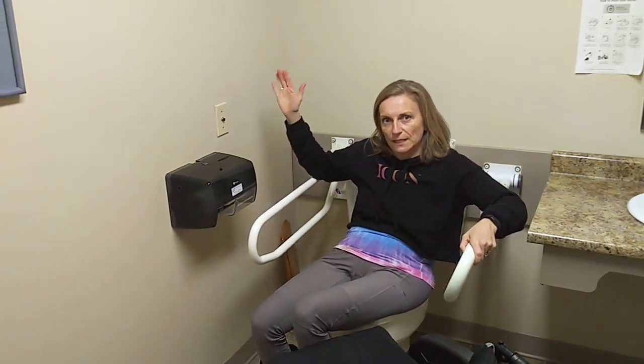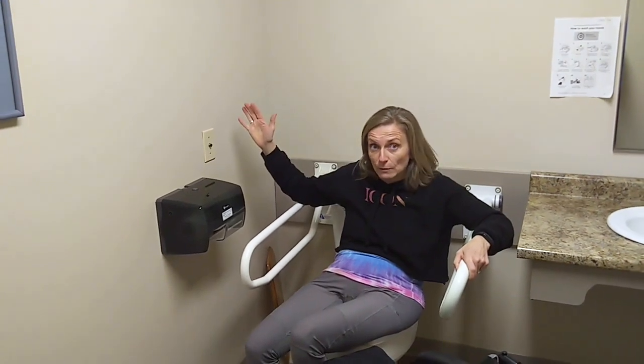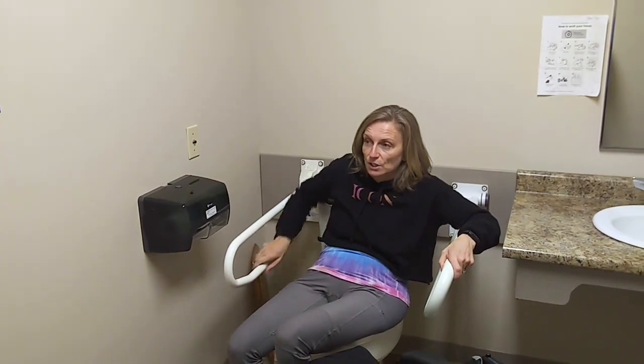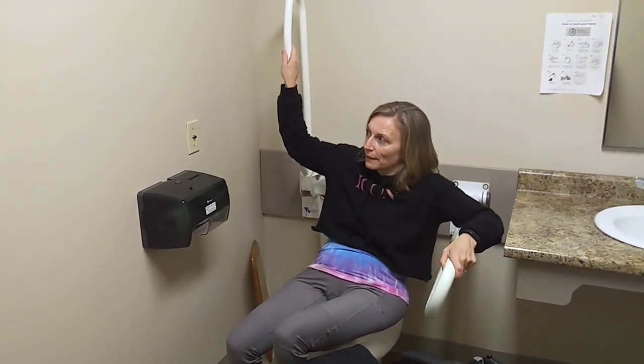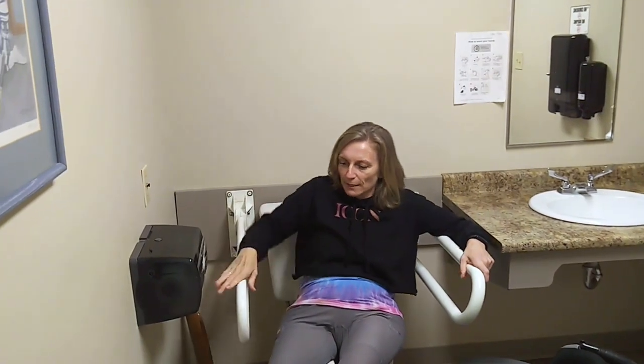A bar that locks in place is useful in some situations, like where a caregiver might be involved and the person sitting on the toilet — you don't want them to pull down the grab bar, so you want to keep it locked up and out of the way until it's ready to be used. But in a situation like this, having one that locks means a person at the front of the toilet can't just pull it down to make it useful. So that's the tricky part of this.